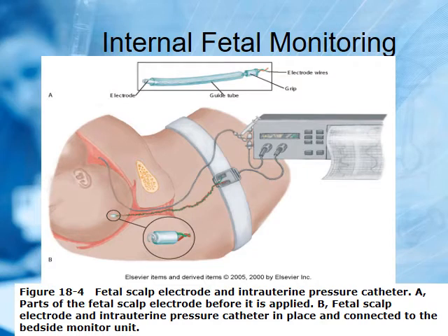Okay, here are the fetal scalp electrode. All right, here's the red and green coil. You see that there? That is the internal fetal electrode. It's not a screw, but it goes just inside the surface of the head. See that? Looks like a little screw, but it doesn't screw in, okay? Everybody kind of worries about that. It doesn't.